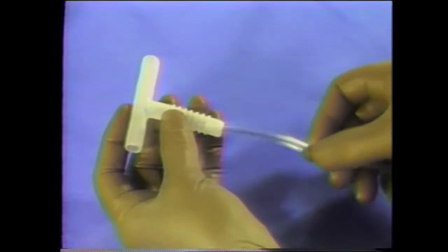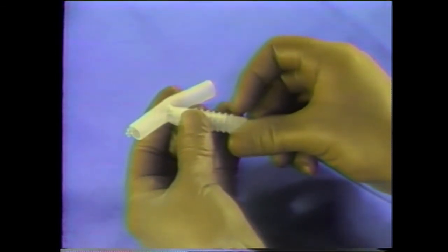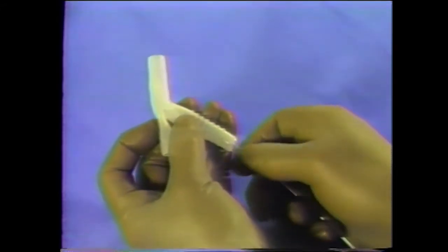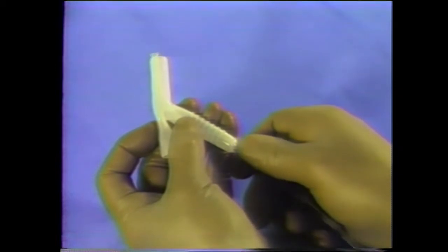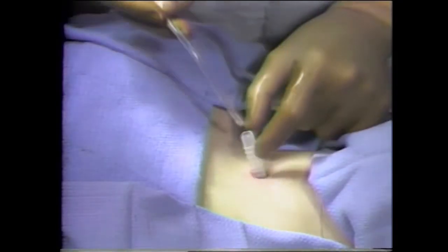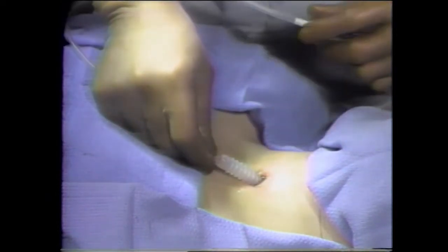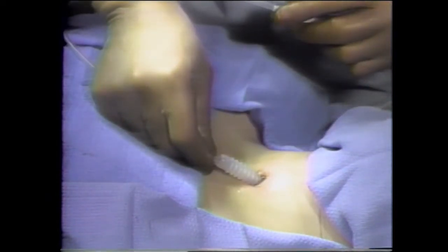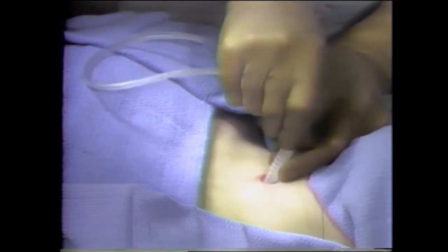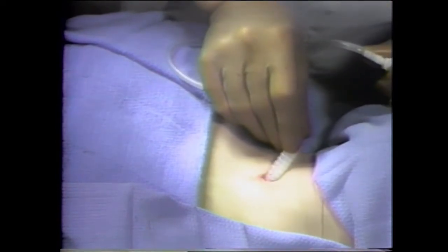Suctioning of the safety tube is quite simple. The extraluminal portion of the safety tube is tilted inferiorly or superiorly in order to direct the catheter. Suctioning is being accomplished following insertion of the safety tube first in a superior direction and then inferiorly. It is not necessary to insert the catheter beyond the end of the intraluminal portion of the safety tube, for this will serve only to irritate the mucous membrane and initiate a cough reflex.